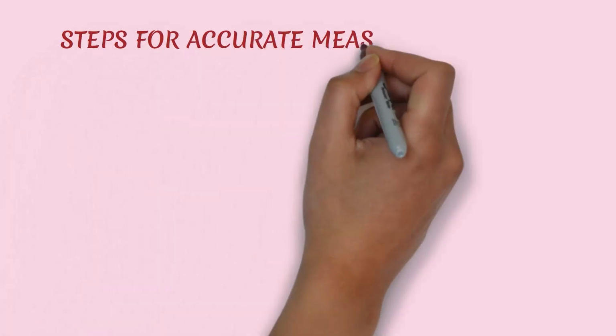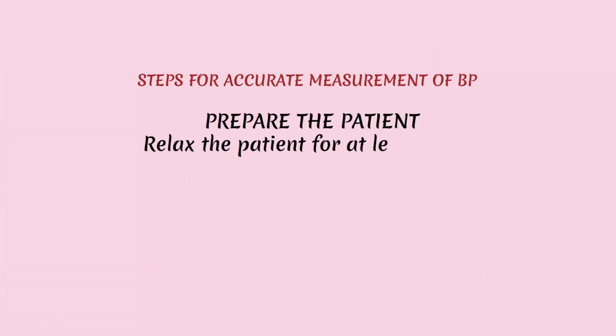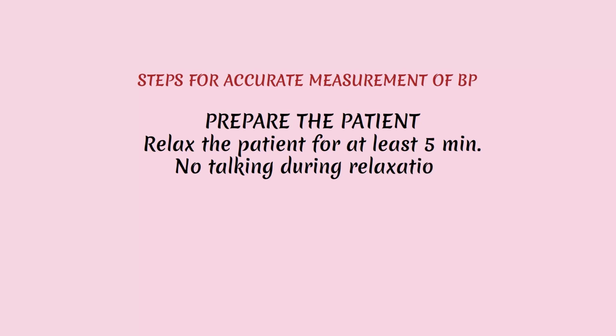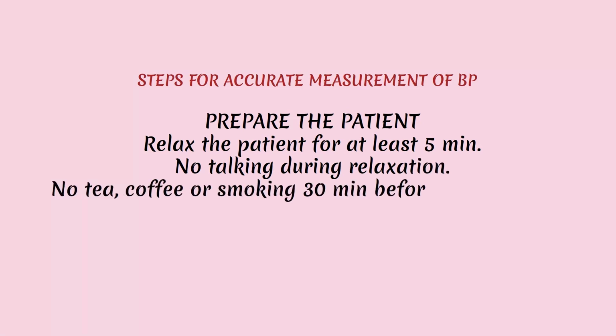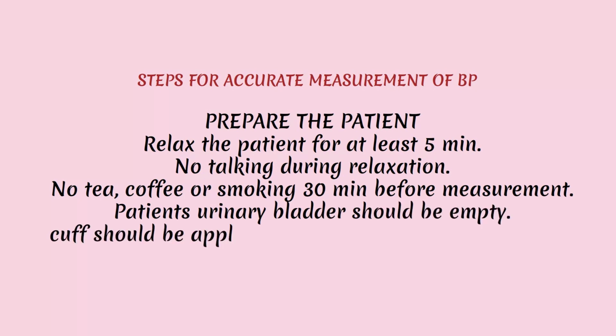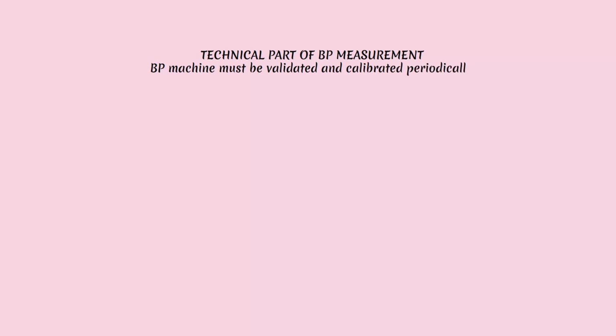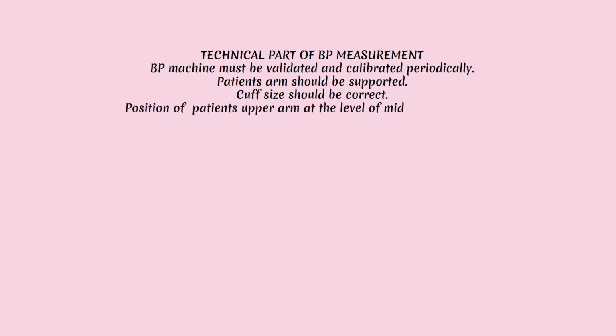Steps for accurate measurement of BP. Prepare the patient. Relax the patient for at least 5 minutes, no talking during relaxation. No tea, coffee or smoking 30 minutes before BP measurement. Patient's urinary bladder should be empty. Cuff should be applied tightly over skin, not on clothing. Technical part of BP measurement. BP machine must be validated and calibrated periodically. Patient's arm should be supported. Cuff size should be correct. Position of patient's upper arm at the level of midpoint of sternum, that is at heart level.